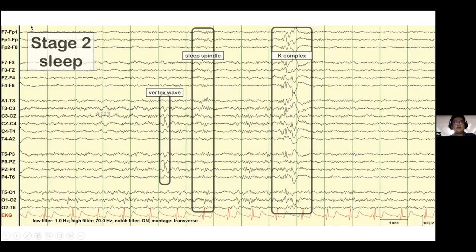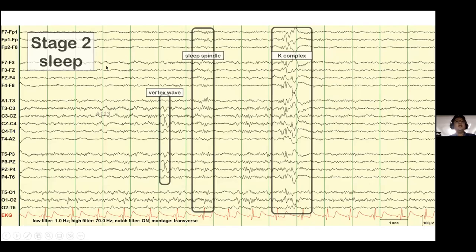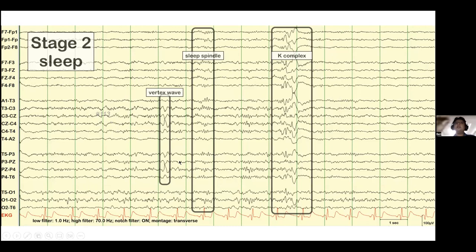As we go further into sleep, sleep transients come out. Stage one includes vertex waves and posterior occipital sharp sleep transients (POSTS). As you go into deeper sleep in stage two, you will get sleep spindles and K-complexes.